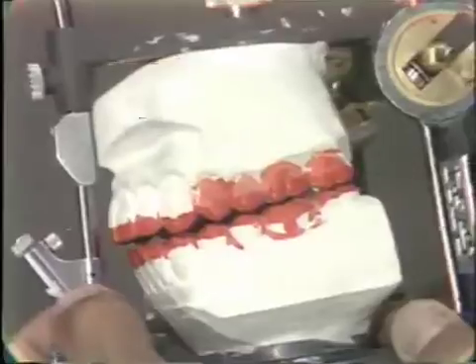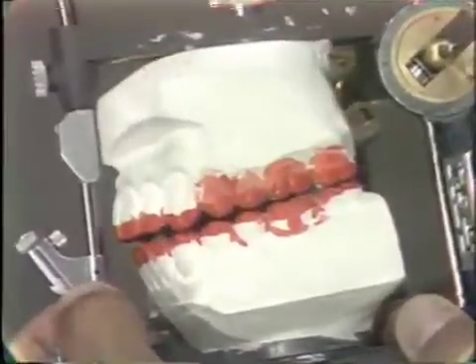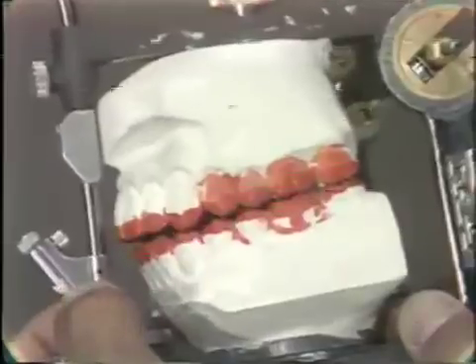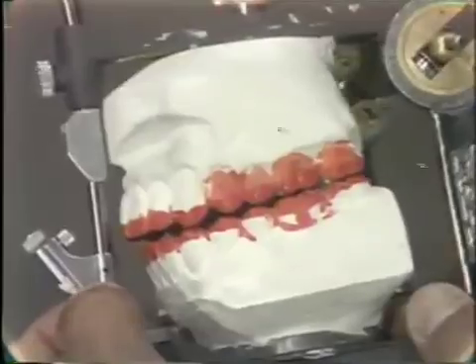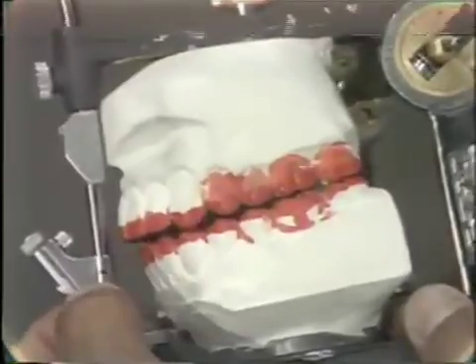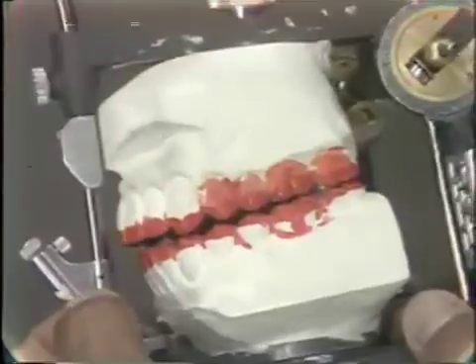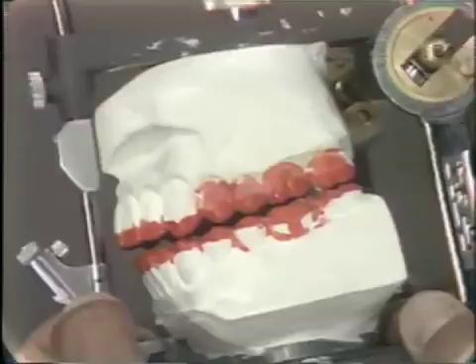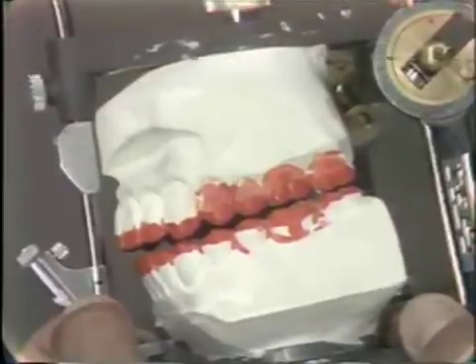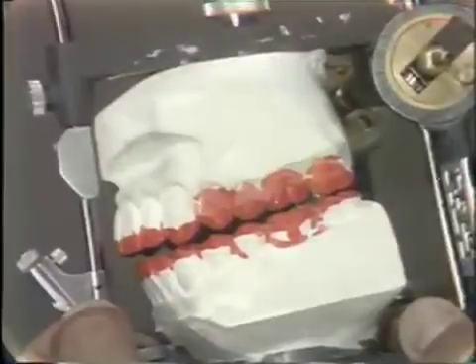Something that you cannot feel through the television is the fact that this is a very smooth and even movement, and there is no tripping or binding in this excursion. So in the working on this side, one of the acceptable guidances is a cuspid guidance with a very stable cuspid and no balancing interferences on the other side.